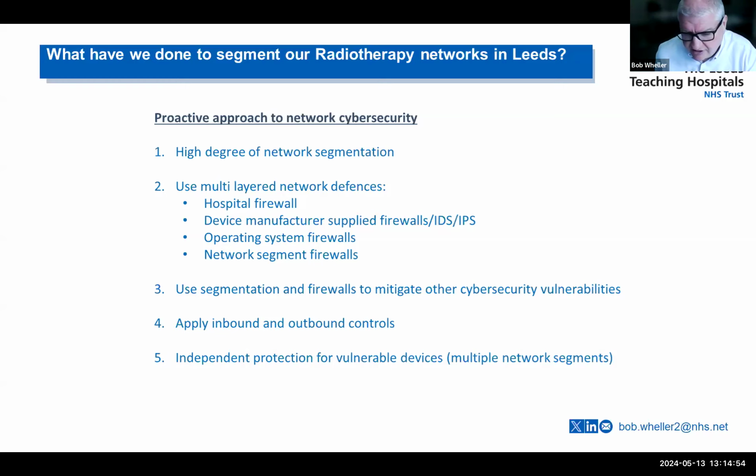So we decided to create segments for each individual device. That's evolved a little bit over time, and I'll mention that in a short while. And we wanted to control and have visibility of our network segments.